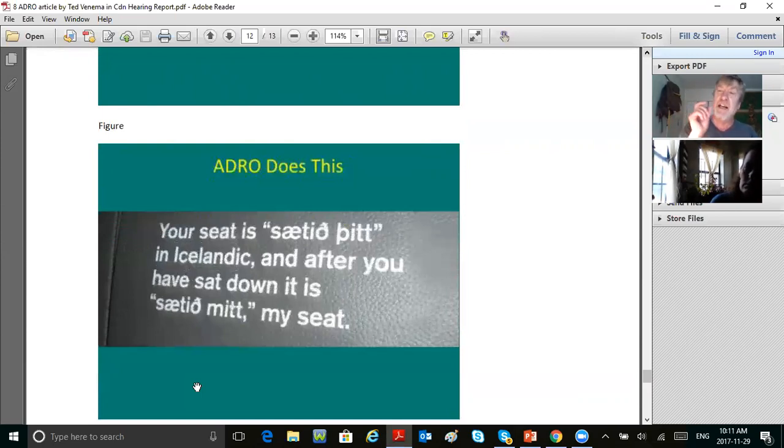And that's the idea behind ADRO. It works all the time in a linear fashion, though. It never uses compression. It either uses less linear gain or more linear gain. A totally different scene. And I wanted to finish the course with a brief description of this weird hearing aid.